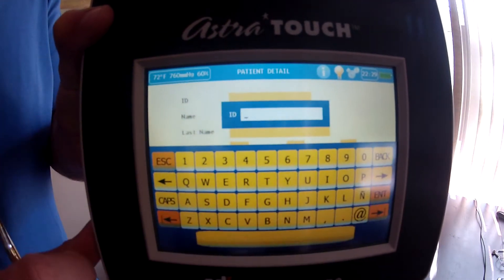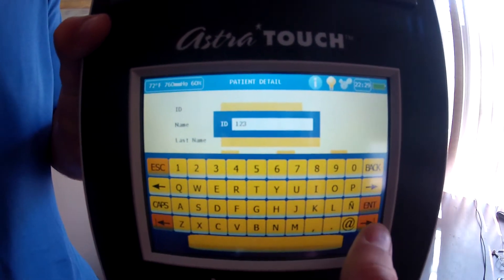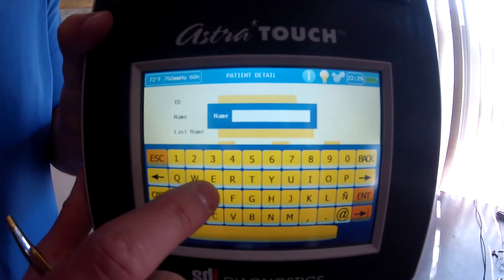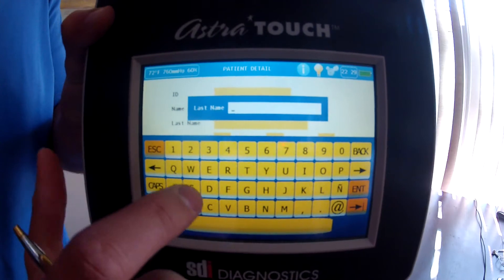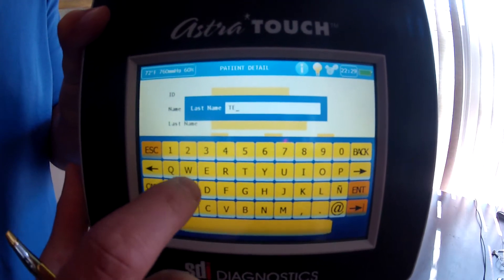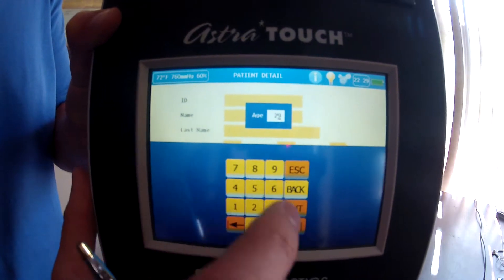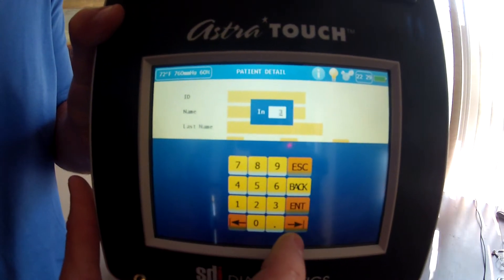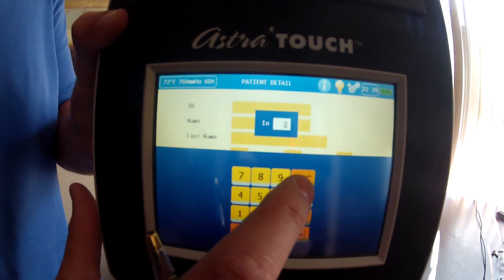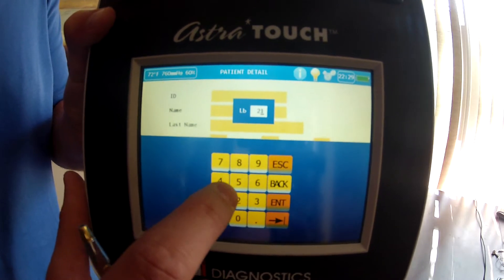I'm going to touch the first box and put in a sample number for the patient ID. Go next, then the patient's first name — I'll put in a random name — and then last name I'm going to put 'test.' The patient's age is 29, and height in inches is 74 inches.